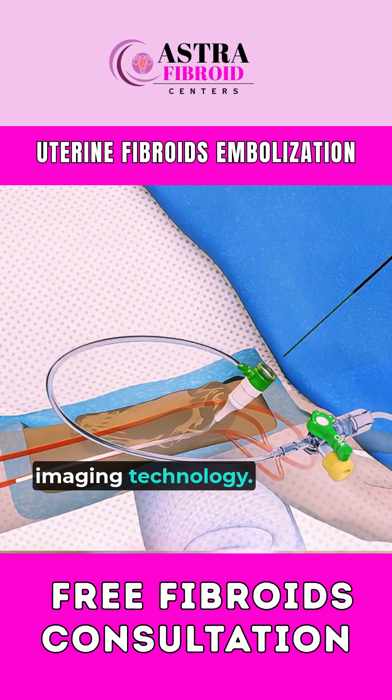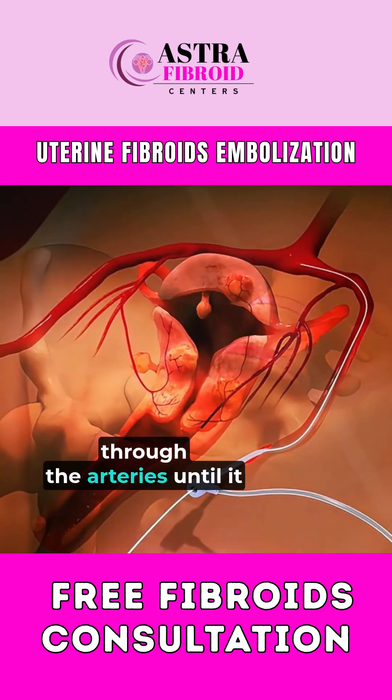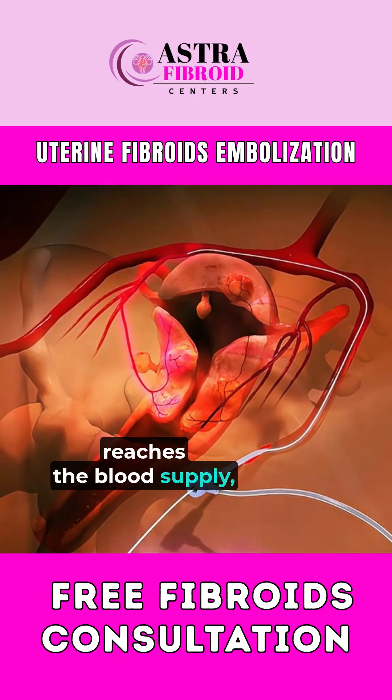Using advanced imaging technology, the catheter is carefully guided through the arteries until it reaches the blood supply feeding the fibroids.